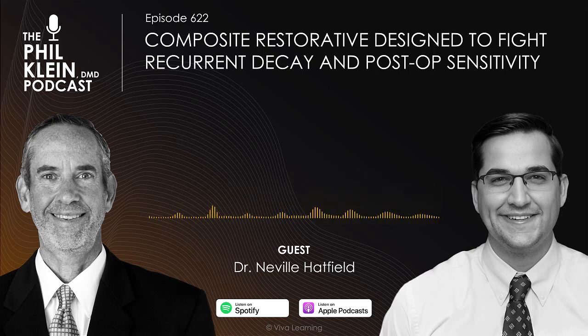I think the most common one nowadays is something called a 7th generation bonding agent, but essentially what that means for everyone out there who's not a materials nerd like me is that it can be used in almost any technique, meaning that you can etch with phosphoric acid, selectively or total etch, or you can use a self-adhesive or the self-etch capabilities of your bonding agent in order to really do right by the patient in terms of having a good bond.